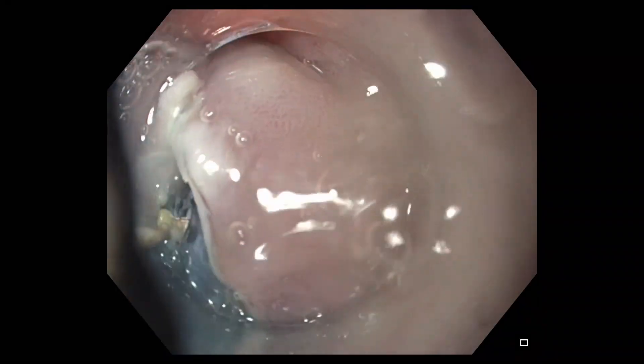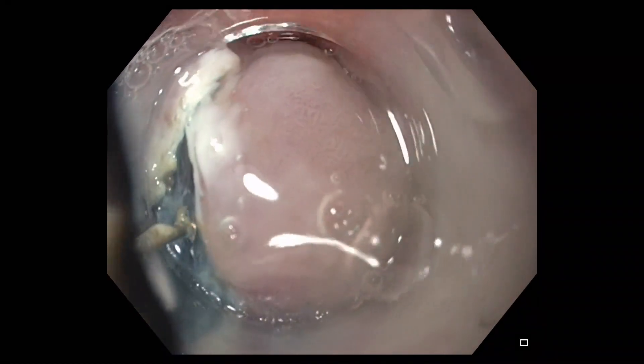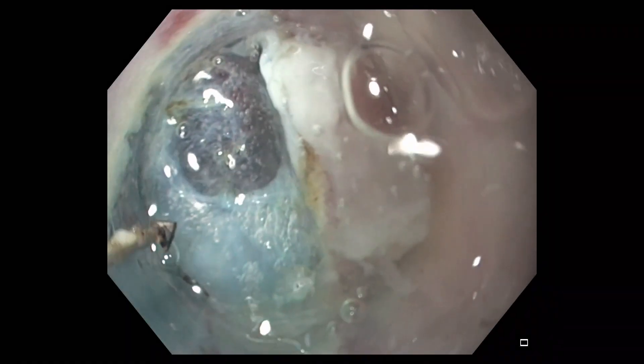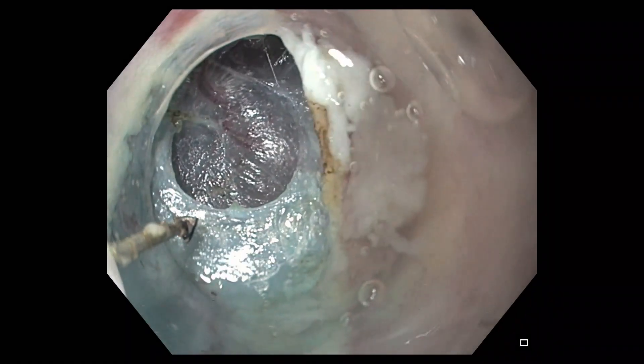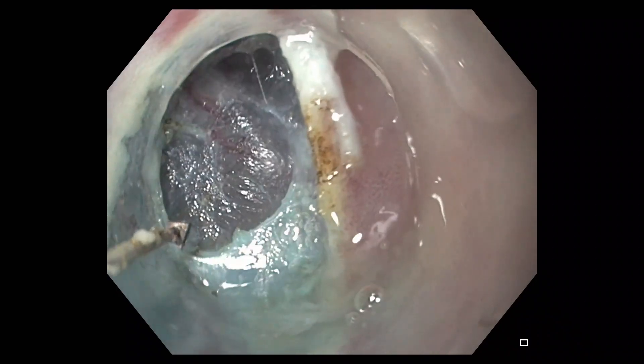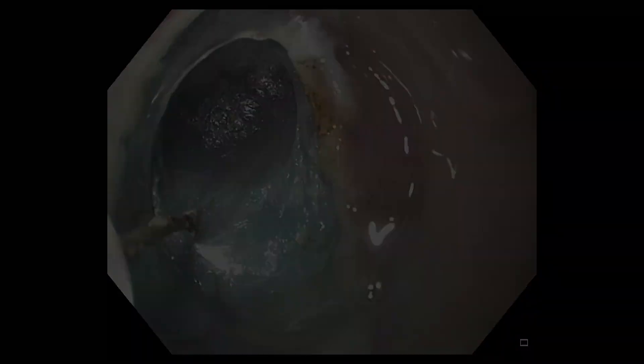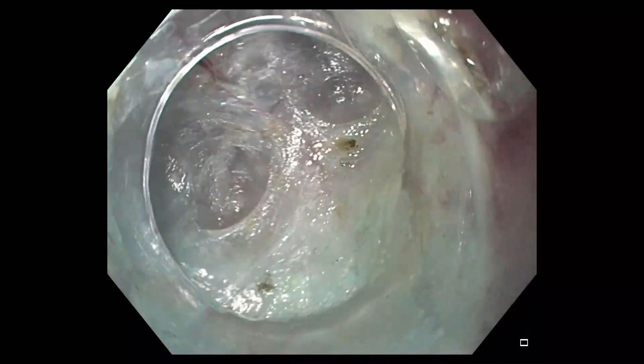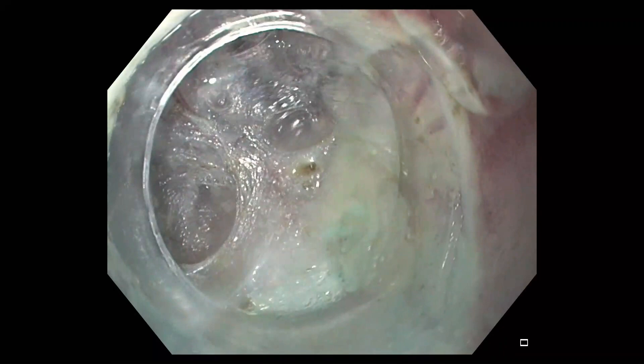Spray coagulation mode is used to systematically and carefully dissect the submucosal fibers near the mucosal entry. Dissection of these fibers subsequently increases the diameter of the opening and allows access of the gastroscope prefitted with a clear cap into the submucosal space.